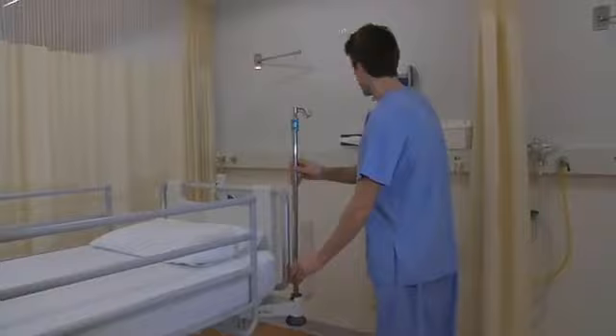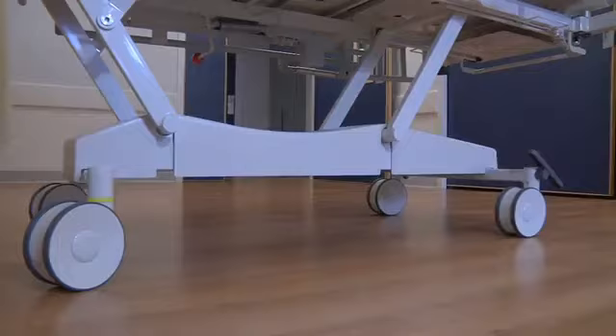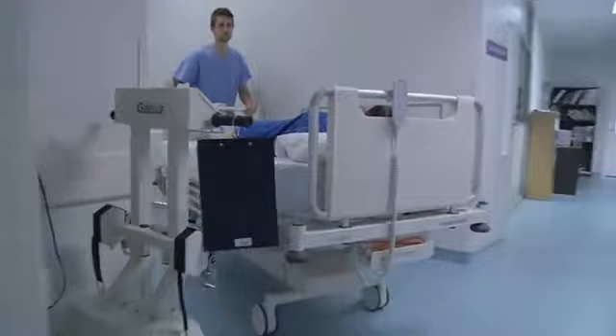Also available are a wide range of accessories such as IV poles and holders for three sizes of oxygen bottles. And when it comes to moving the M9, the latest generation of linear casters offer less rolling resistance and complete ease of manoeuvrability.